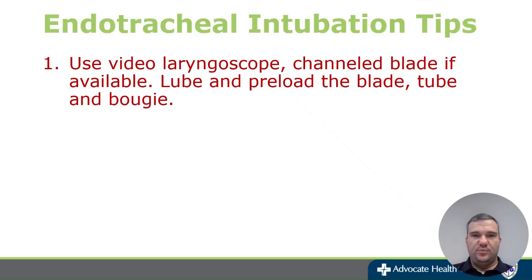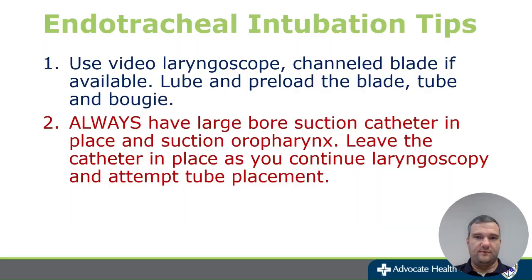Tips. Lubricant is important in the intubation setting. You can lube the blade. You can lube the edge of the tube, especially by the balloon. That helps it pass through the cords, and then lubing the bougie as well. I know this is kind of an added step and takes time, but if you have some lube and just put it on your finger and put it on those areas, it only takes a couple extra seconds, and it definitely does increase your success rate to prevent you from getting hung up on any of the anatomy as you're advancing your blade and the tube or the bougie through that area.